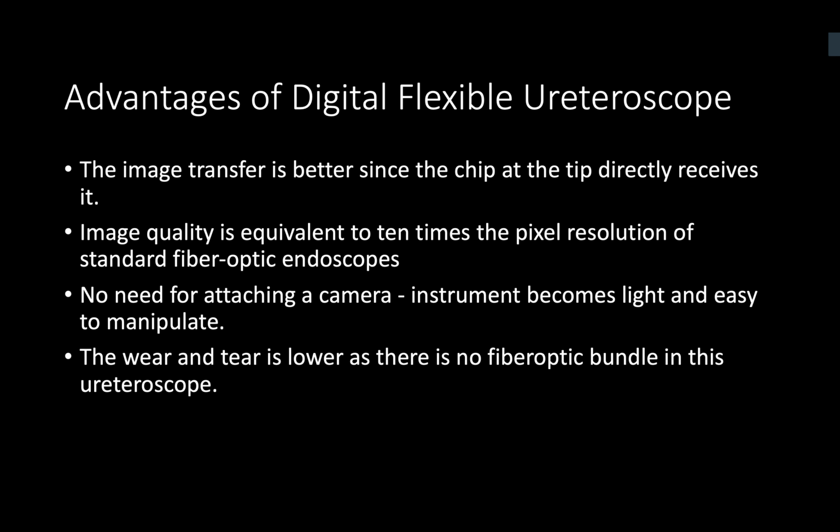And they have been found to be lighter as well. And the main advantage is the image quality that's reproduced. It has a better definition than the conventional scope. The disadvantage is concerns about the impact on the environment.